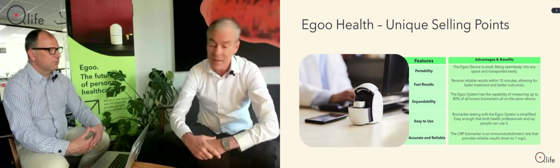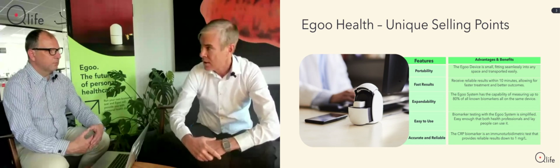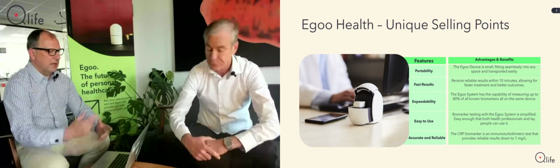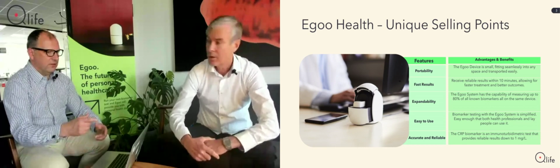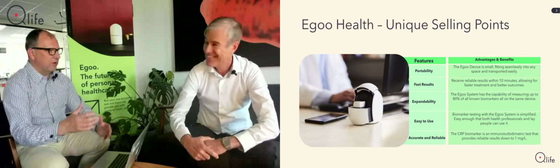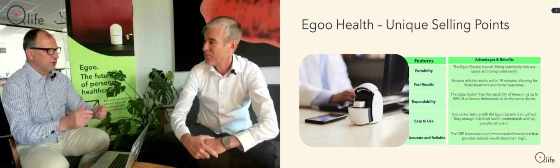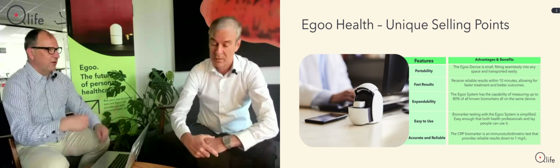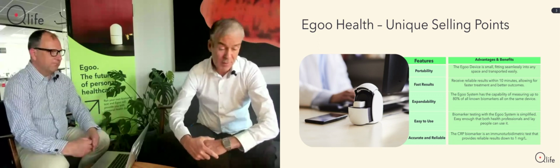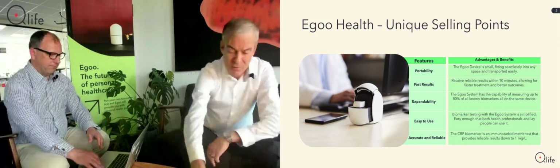Good. And so that's how we intend to use CRP, our CRP capsule, as an indicator for basically how you are doing. Yes. Later on, when you actually perform the test and we get the result, will you elaborate for the audience? I know you have different levels. Is it acute, or is it okay, or do you have a healthy lifestyle? I hope you will get back to that. Yes, I will get a little bit into that. Good. But before, as I said, I think we would like to demonstrate the system.